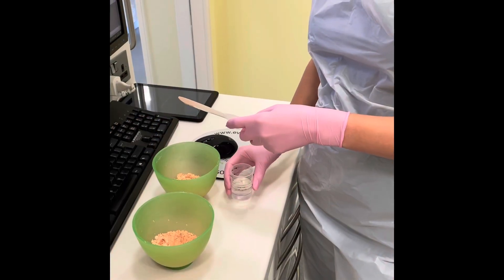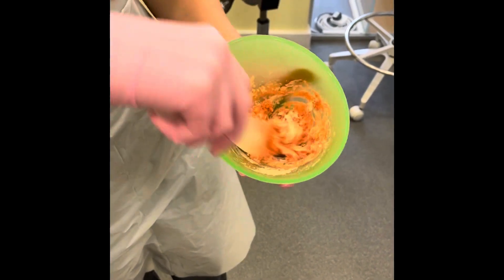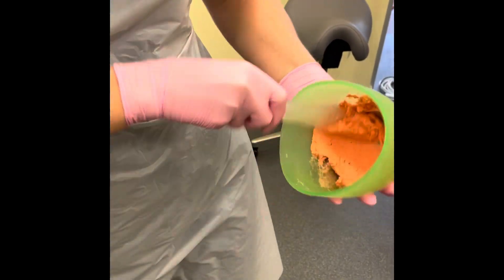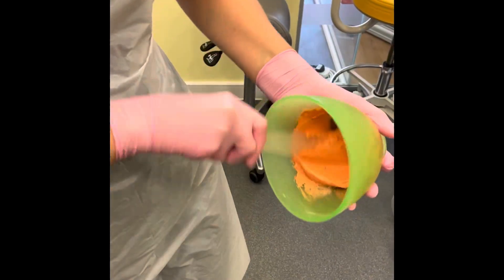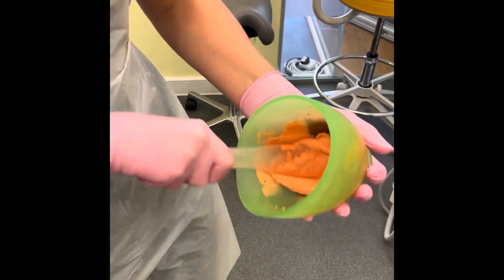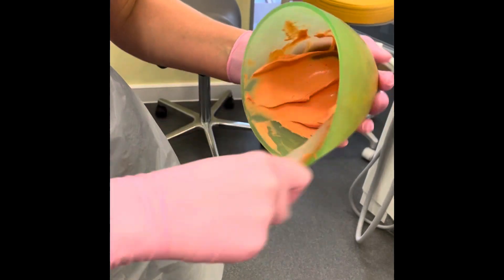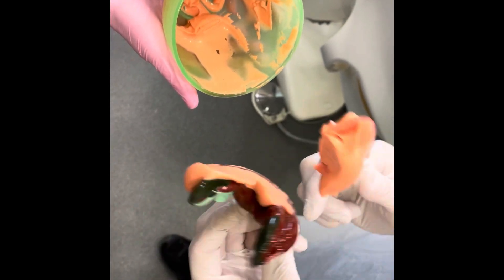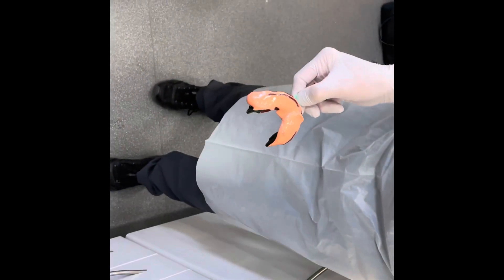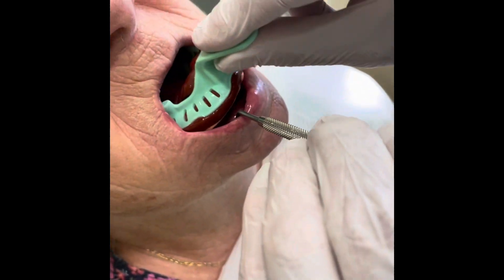Just to confirm — do the bottom one first. We're getting fairly close; it's the smooth mix we're trying to get. Not too much pressure. Now that's about done with loading it. Don't faff with it — under the tap. It's just going to reach round about. Mirror to retract the tissues, seat the tray.